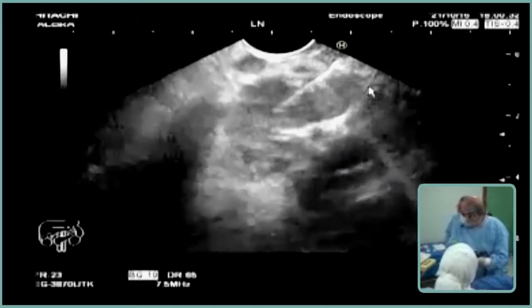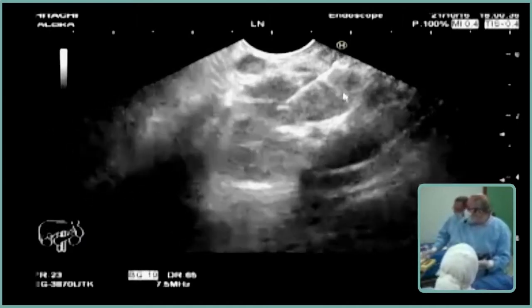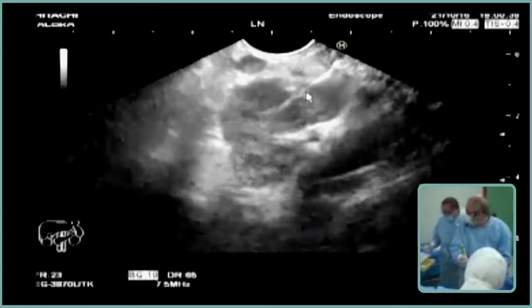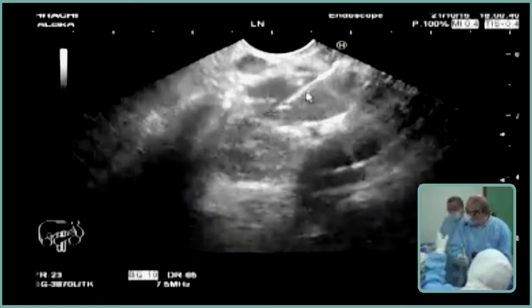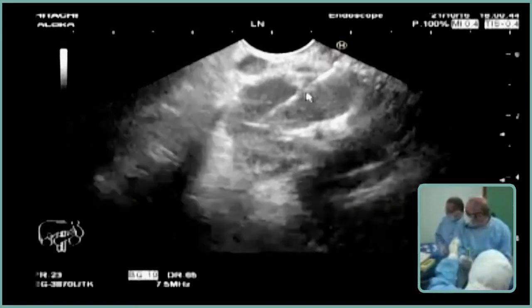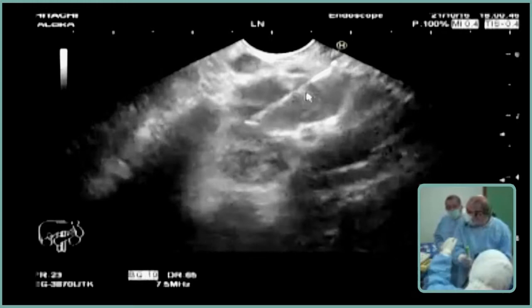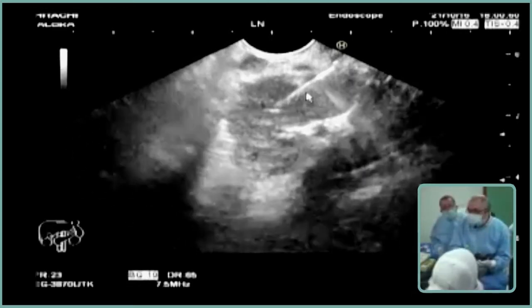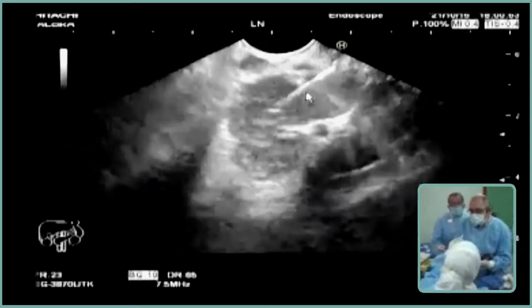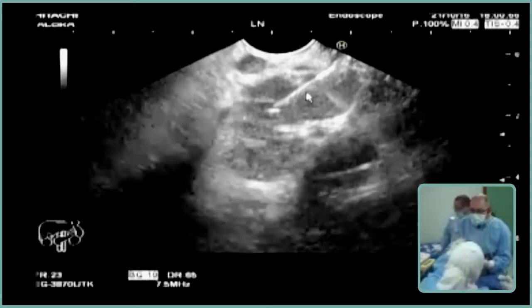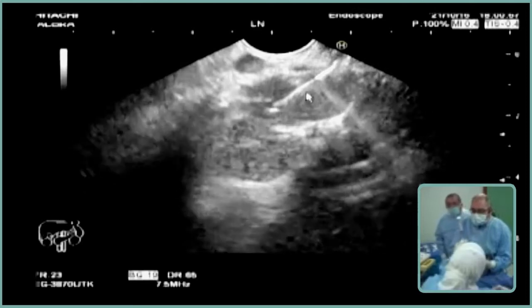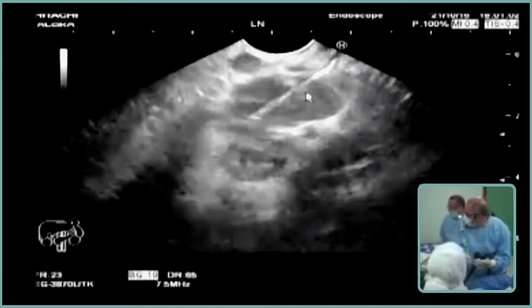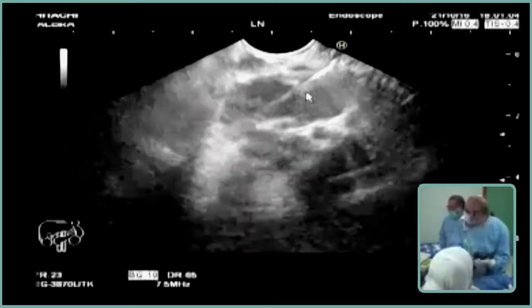I am now inside. I am moving to and fro — very nice. Now I use the slow pull technique — gradual withdrawal of the stylet. This is the slow pull or low pressure technique.